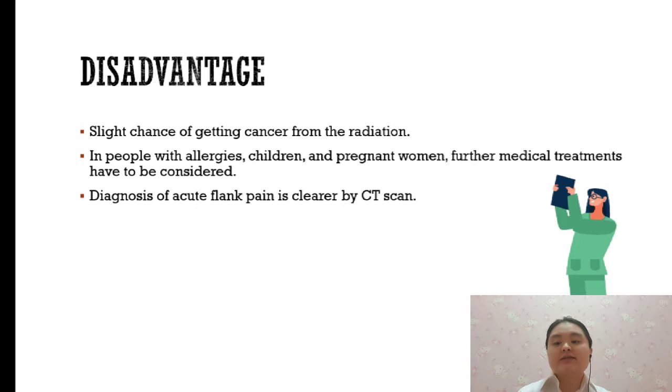So first, there is a slight chance of getting cancer from the radiation. Second, in people with allergies, children, and pregnant women, further medical treatment has to be considered. And the third one, diagnosis of acute flank pain is clearer by CT scan.